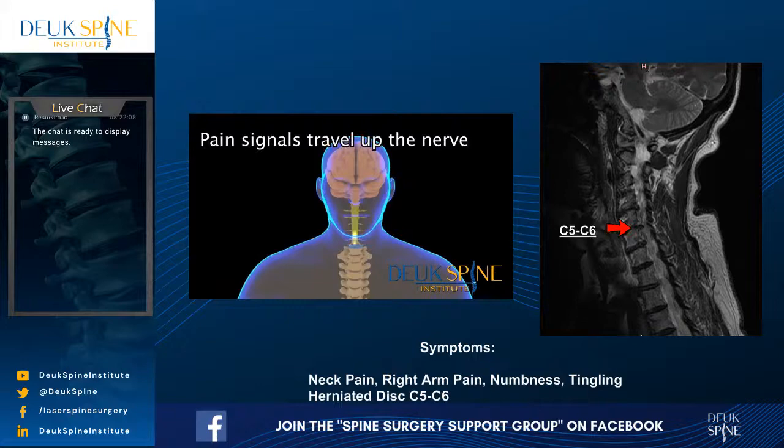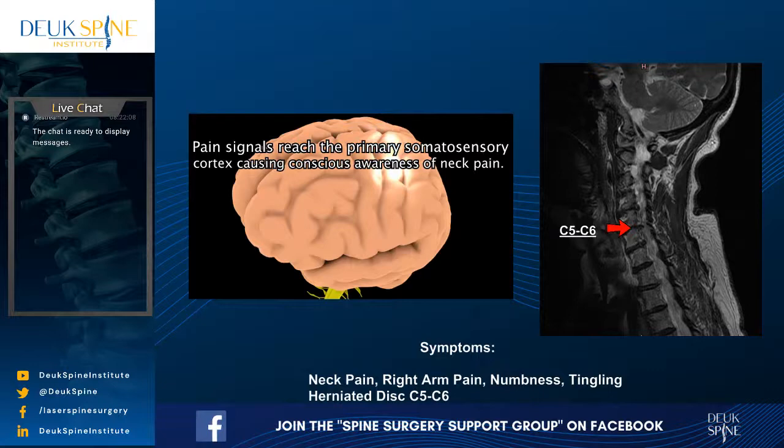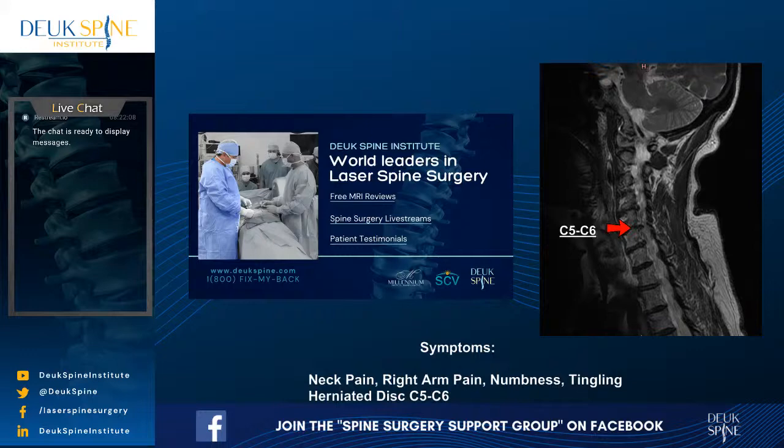All right, we're going to get started. Our patient is asleep, lying on her back, intubated. My first step is to feel the spine and create a safe path to the spine. Shot. Remember, we're going to C5-6, so 2, 3, 4, 5, 6. It looks pretty good there. Let me just check it again. Shot. Well, why are we so overexposed?